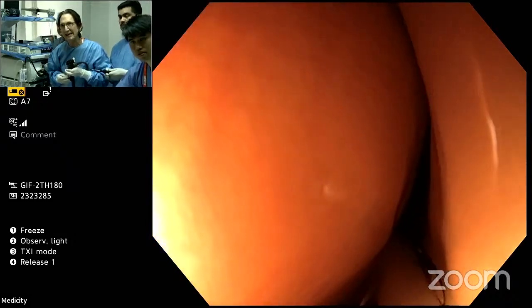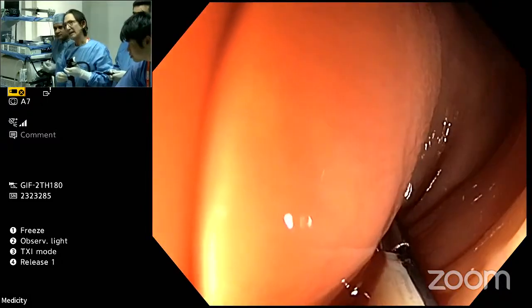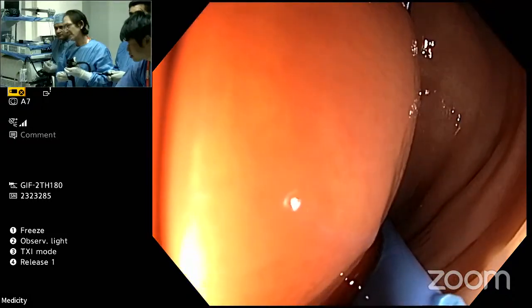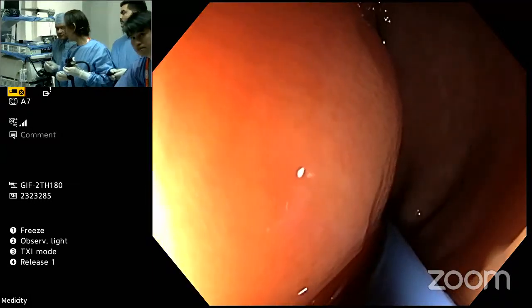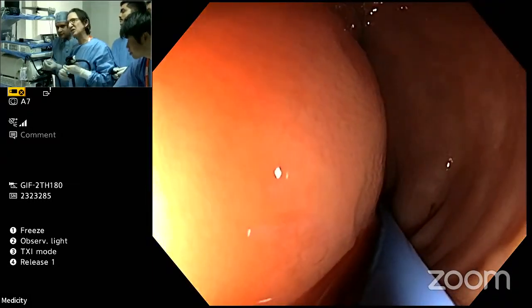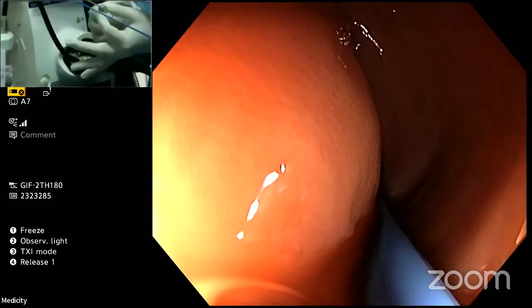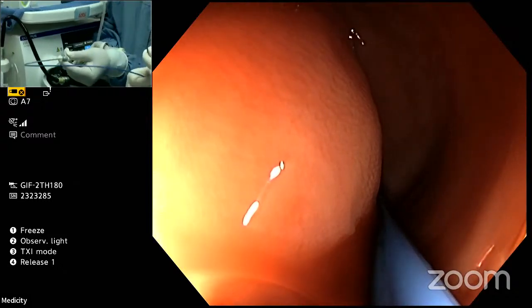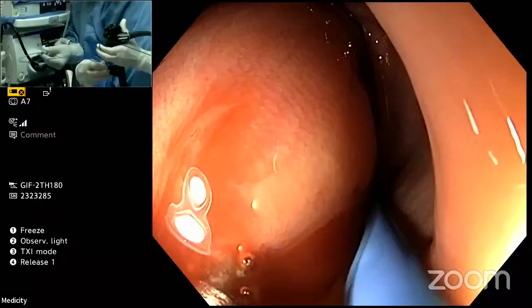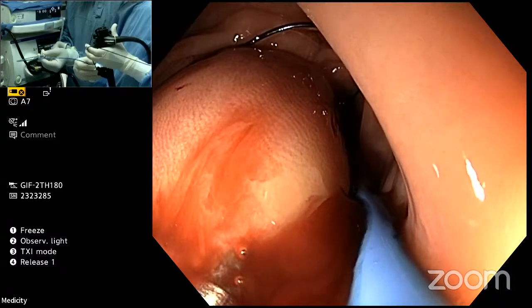It's blind, but now you're going to close by advancing this forward like this. All right. And when it's tight, so advance it all the way forward. Is it tight? You feel it tight? Do you feel that it's advanced all the way? All right. Now you're going to close the loop here. So this is the thumb ring. You're going to pull the thumb ring. Yeah, close all the way. Close it all the way until you don't feel it go forward anymore. So all the way. All right.